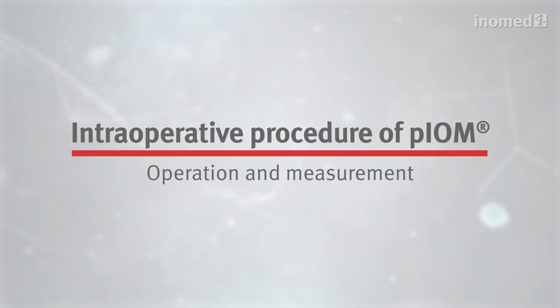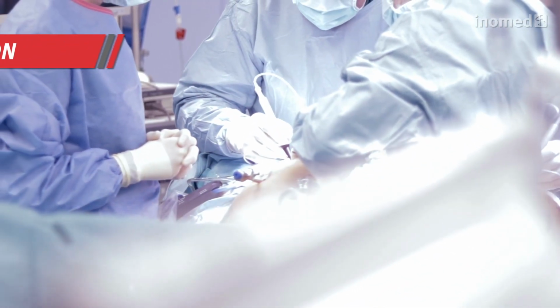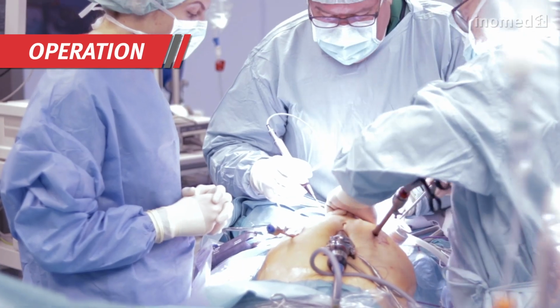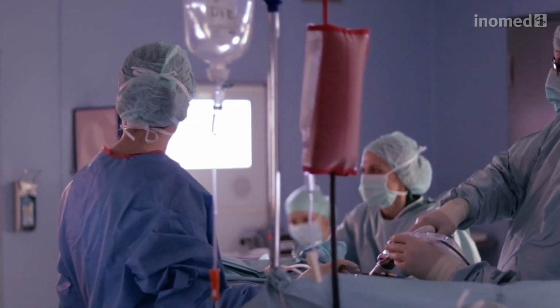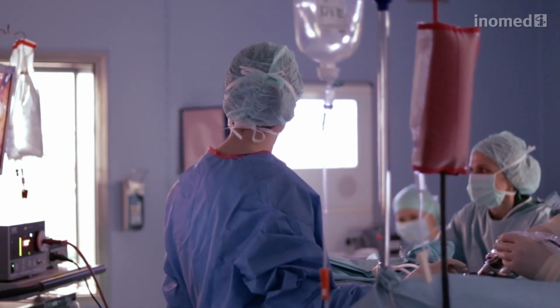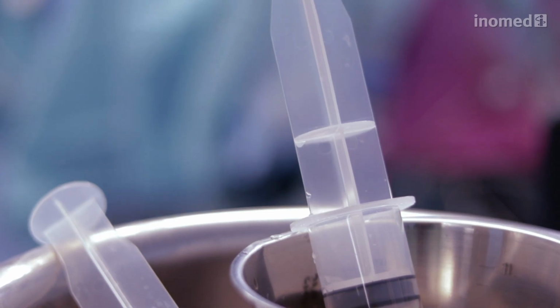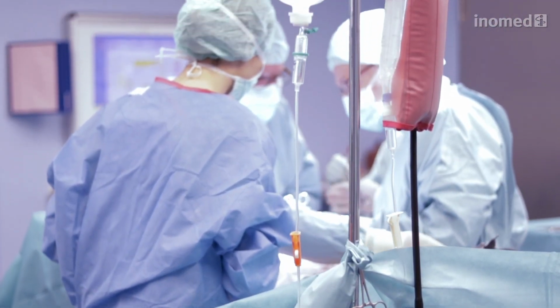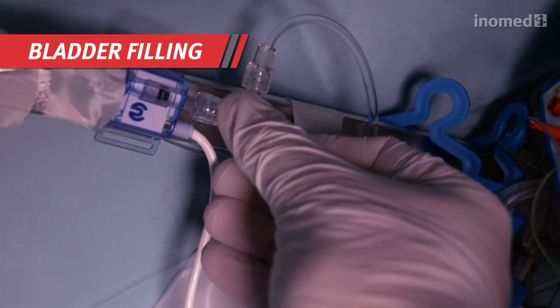pIOM can be used for various operations, including all operations taking place in the small pelvis, close to the plexus hypogastricus inferior and the nervi pelvici splanchnici. It does not matter whether the operation is performed openly, laparoscopically, robotically, or transanally. When potentially endangered areas are reached, the actual pIOM can be primed in order to identify nerve tissue.